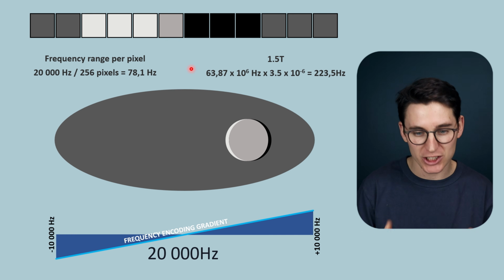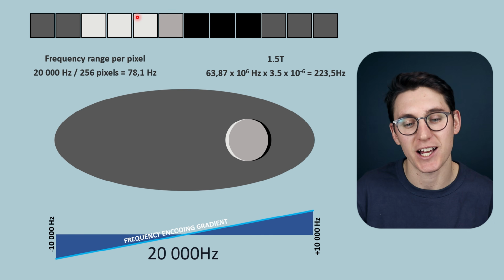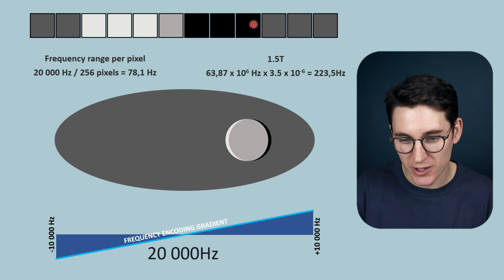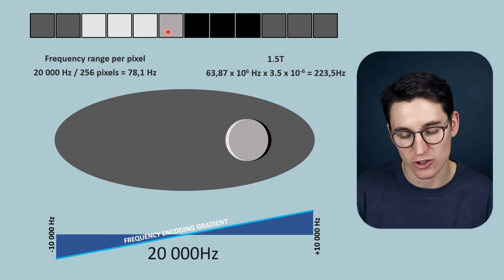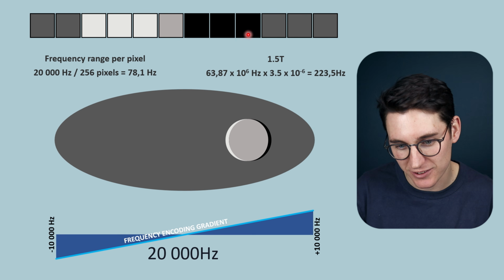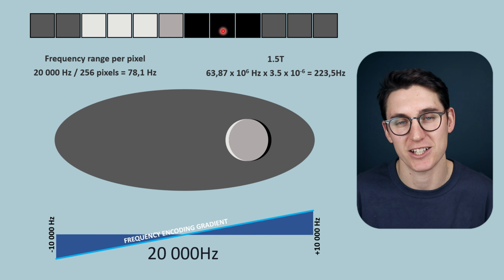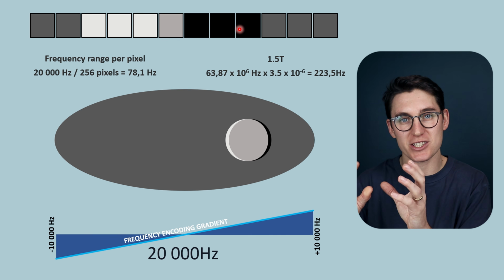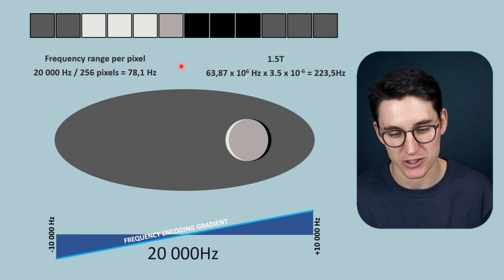What our image is actually going to look like is this. We're combining the fat signal and the underlying water signal on this region. The 1 pixel that had fat in it is still in the area that there is fat. There's no water underlying this, so we get true fat signal here. And we're getting no signal in these pixels here. There's no water truly in this anatomical location, and we've misregistered the signal coming from the fat there as being at a different place in the x-axis location.